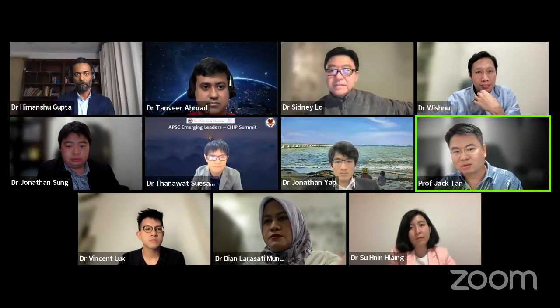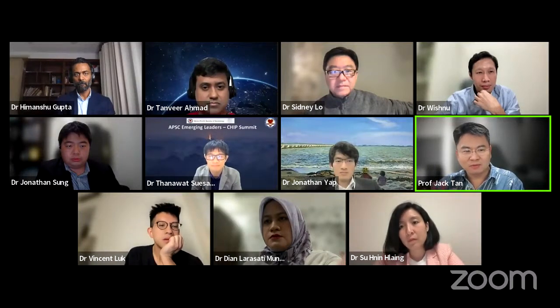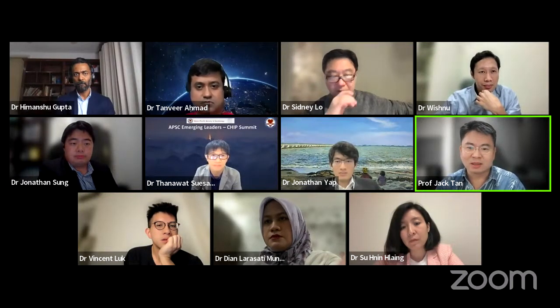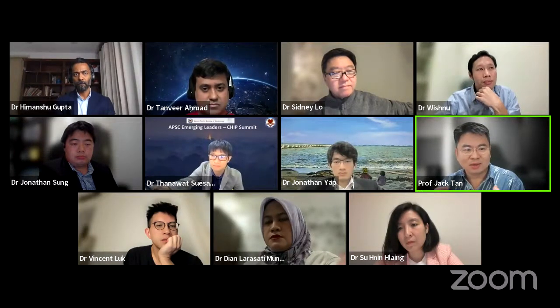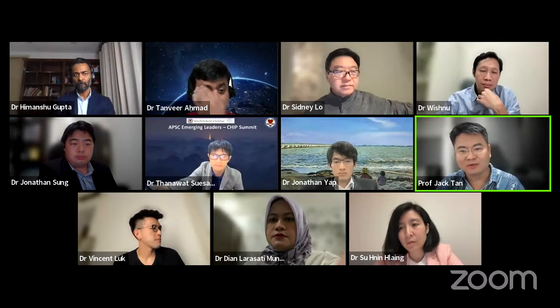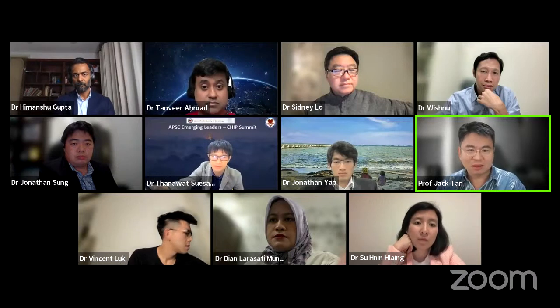One thing about Gupta's algorithm, I know what he's trying to say is that the two cases show really different scenarios where I think upfront rotablator helps. The first case, I agree, is upfront rotablator. Without imaging, you can tell. And then the second one is probably more focal nodular calcium management, which we can debate upon. When you like to go with upfront rotor first, I think it depends on experience and comfort. So I wouldn't advise that as a routine you must do upfront.